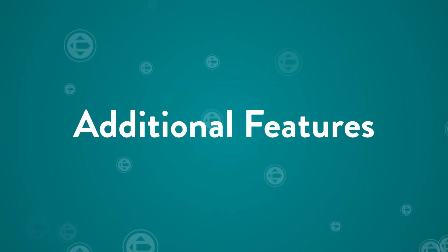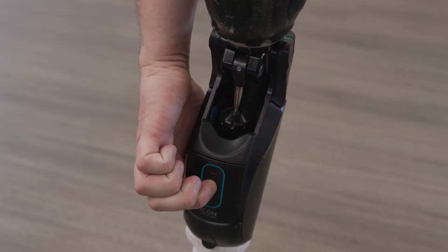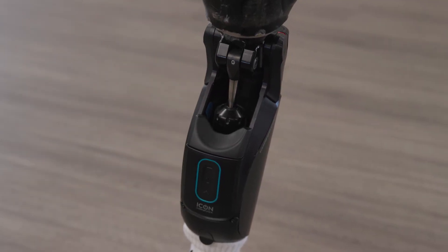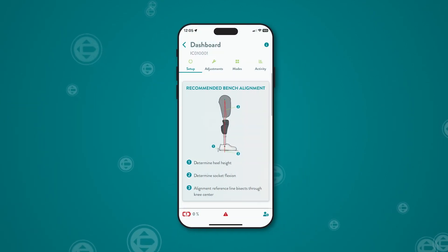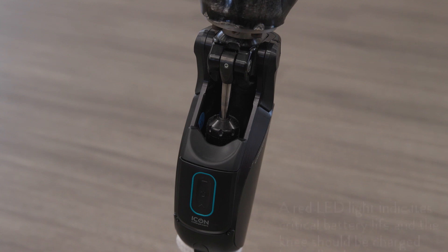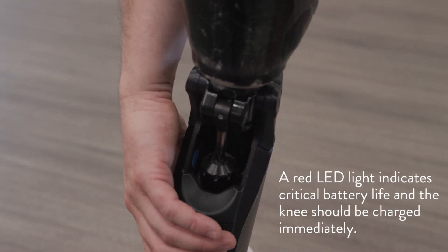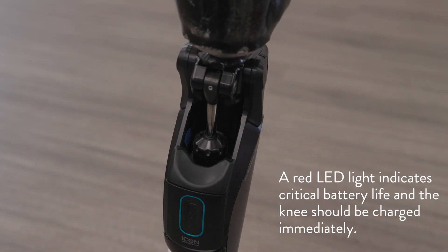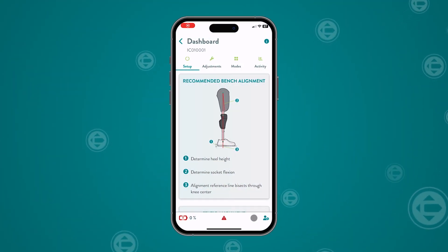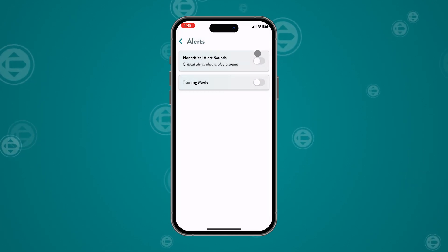These additional features are accessible to both prosthetists and end users. Press and hold the power button for three seconds to turn the knee on or off. The battery status of the knee is displayed in the lower left corner of the app. You can also check the battery status by pressing the power button for one second — the LED will flash green to indicate the charge level. You can turn off non-critical alert sounds or activate training mode by tapping the alerts icon in the lower right corner.